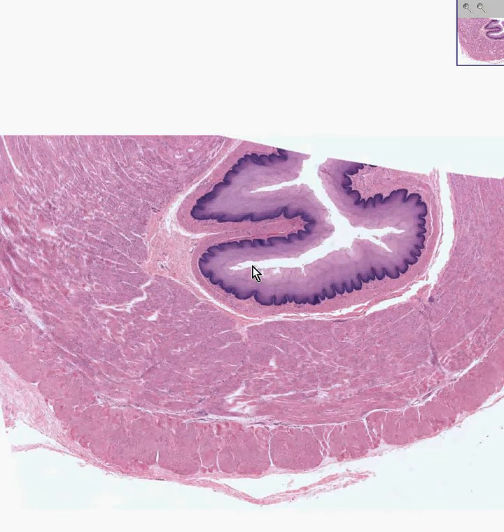And here is an absolutely beautiful cross-section of an esophagus. Notice the non-keratinized stratified squamous mucosa. Notice a very, very nice muscularis mucosa just underneath the basement membrane of the epithelium. Notice the looser connective tissue and fat of the submucosa, and then notice the various smooth muscle layers.